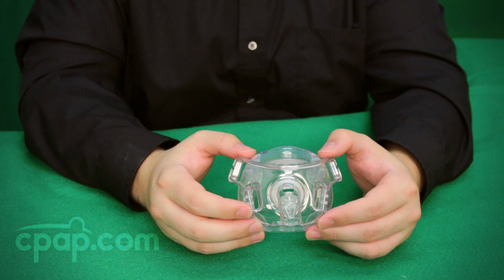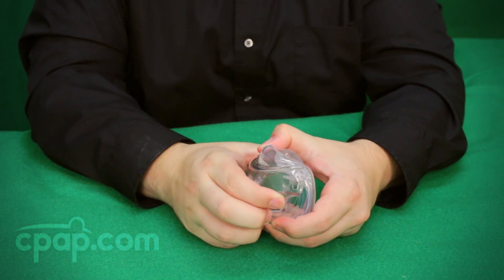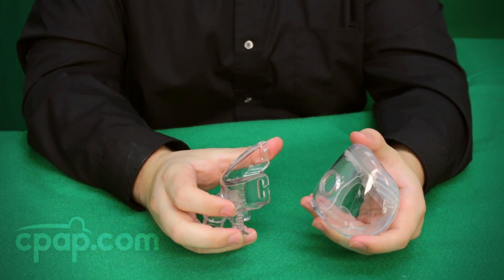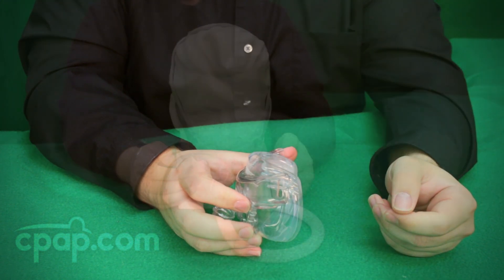The Amara View is available in small, medium, and large. The Amara View frame will fit all three sizes of cushion. So if a larger or smaller mask is needed, only the cushion will need to be purchased and can be added to the existing frame.